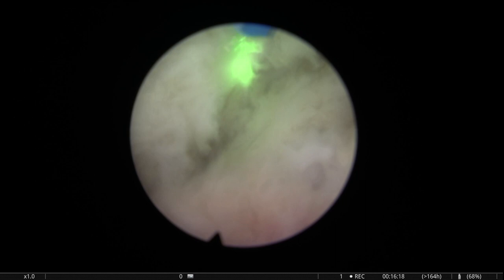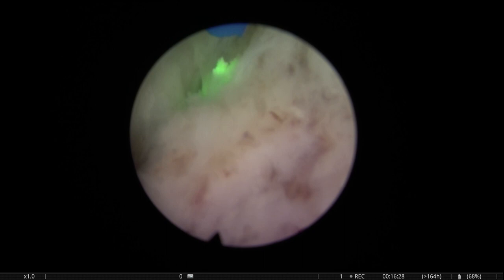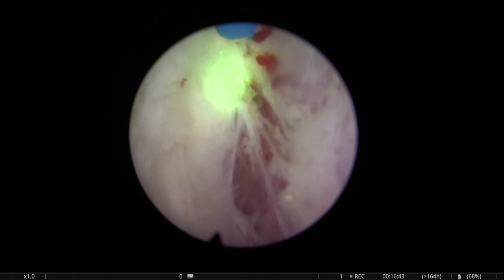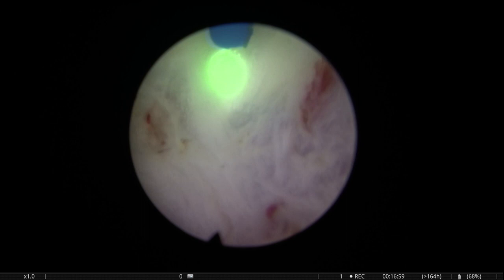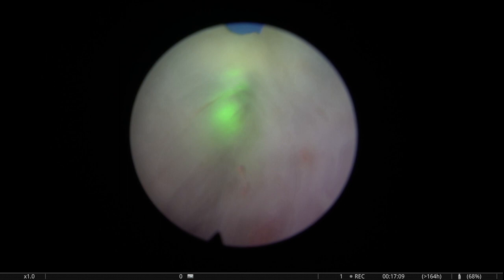One of the nice things of Holmium, and I think it's specifically important in this operation, is that you need to be present, you know. You need to be actively concentrated on analyzing the details you're getting from the anatomy. You are analyzing the distance, how far are you from the tissue? What tissue effect are you getting? Are you able to coagulate at the same time as you dissect or not? You know, these low power lasers have a worse first pass effect, I think, than the pulse modulation lasers I'm referring to. So you have to be present and you have to analyze all the details you're watching.